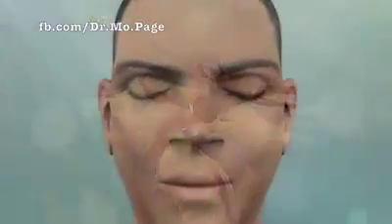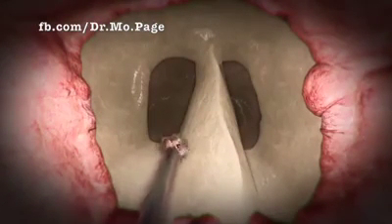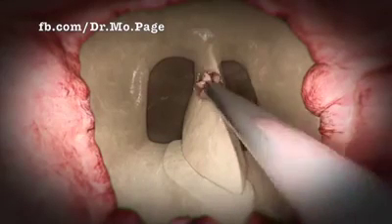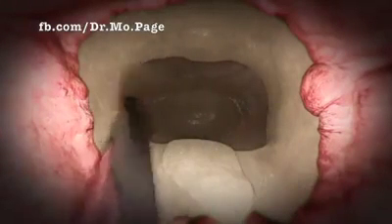To reach the skull base and pituitary, mucosal incisions are made in the back of the nasal cavity that aim to preserve the blood supply to the mucosa and the sense of smell. The mucosa is elevated from the back of the nasal septum and sphenoid bone. The natural openings of the sphenoid are then widened and connected, creating a corridor to the skull base and pituitary. This allows the surgeon to maneuver two instruments within the sphenoid sinus while being illuminated and visualized by the endoscope.